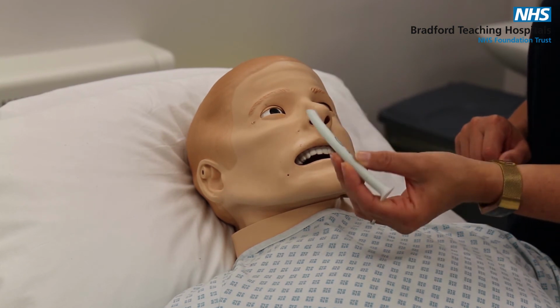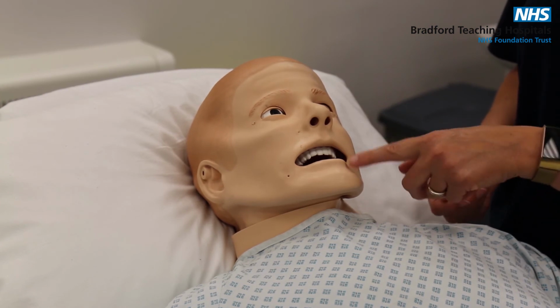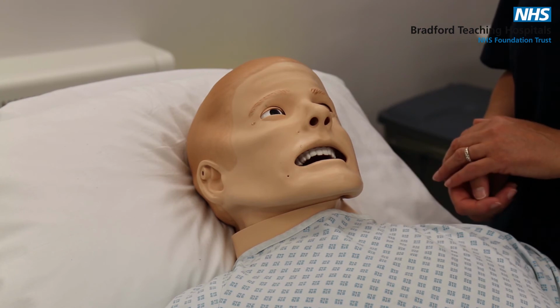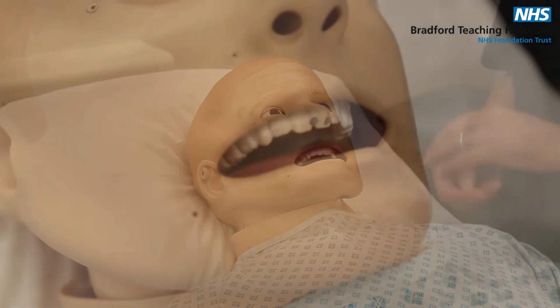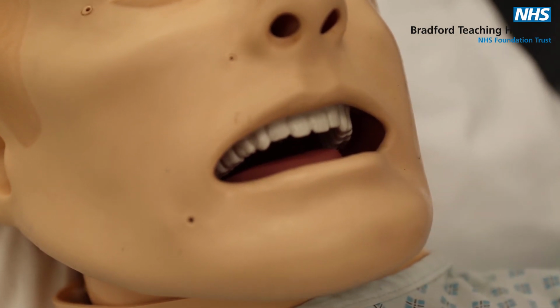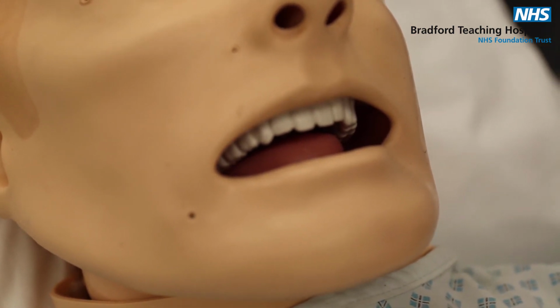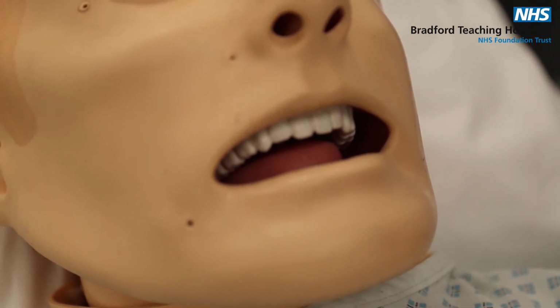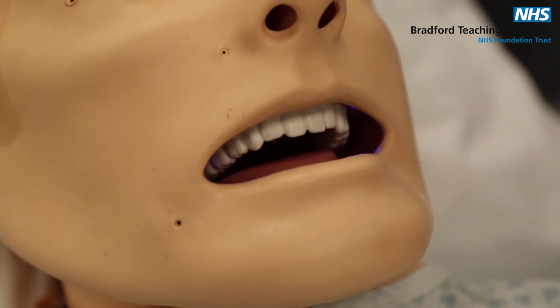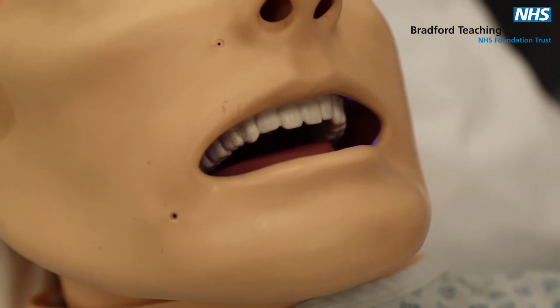So you can insert a nasopharyngeal airway. He can have any type of oral airway inserted, and he can be tubed if necessary depending on the scenario. So Simman can have tongue edema, so this is his tongue in the normal state, and then with the edema you can see the difference between the two. Simman also has cyanosis, and this is simulated with blue LED lights in the mouth.